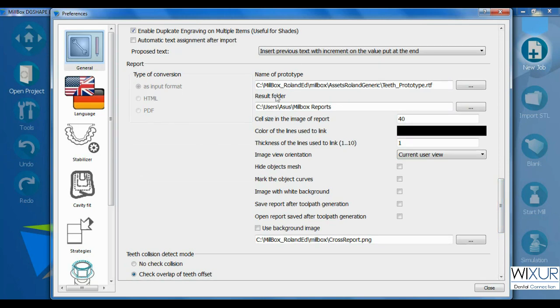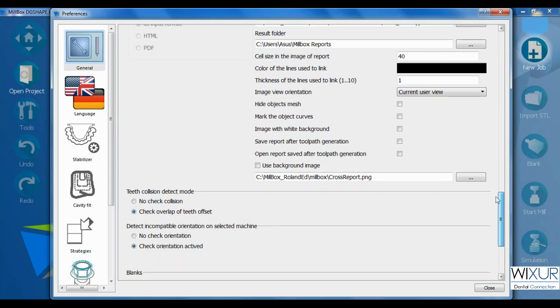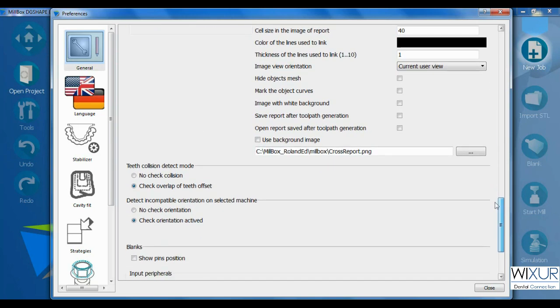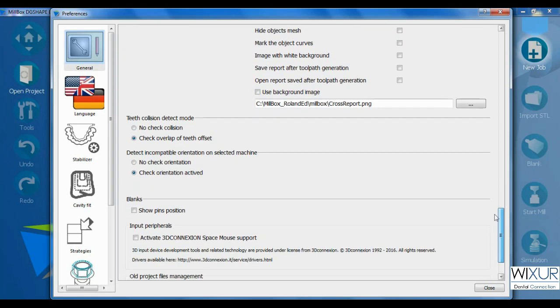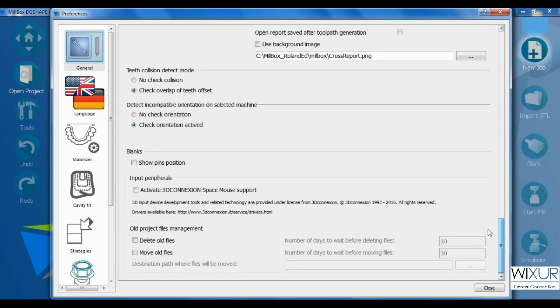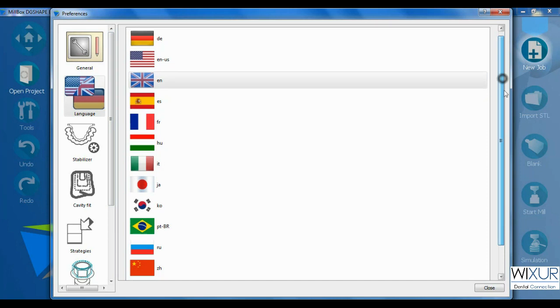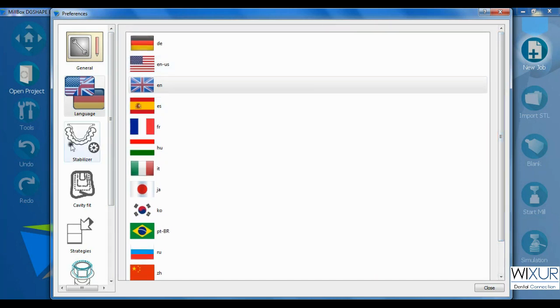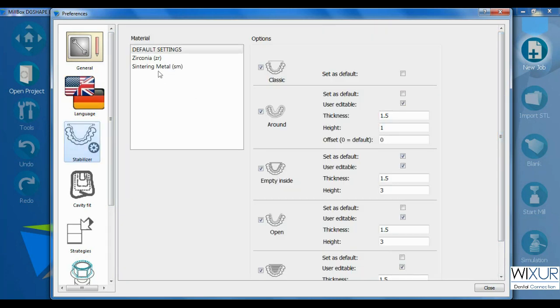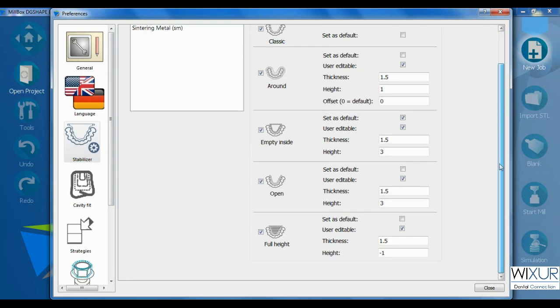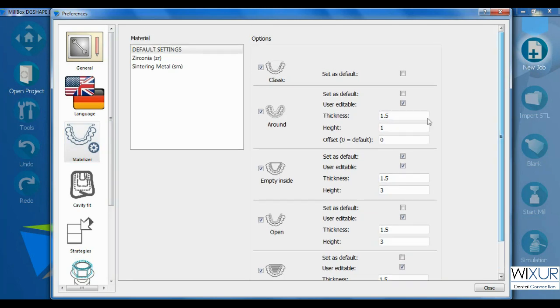That is now enough for the tab general. Next tab is language and you can change software language as desired. For the stabilizers, here it is possible to change some options like thickness and height.